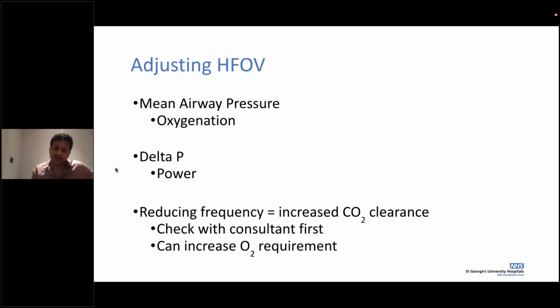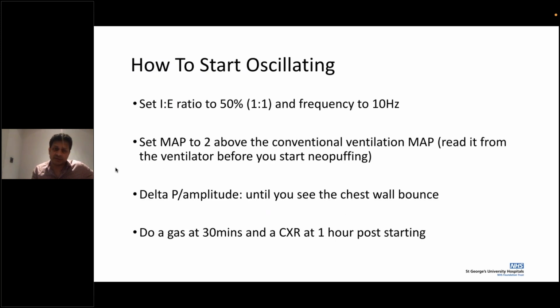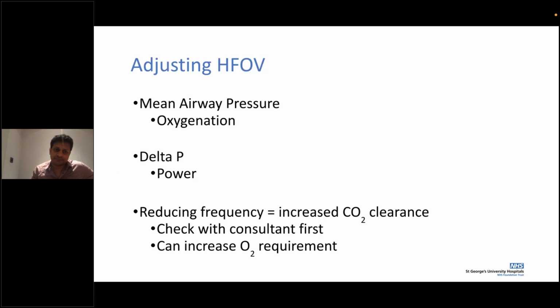Always try to do a chest X-ray straight after, within an hour or so, and a blood gas. That's to see what the chest expansion has been. And generally, when you're talking about high frequency ventilation, these are the things we adjust.